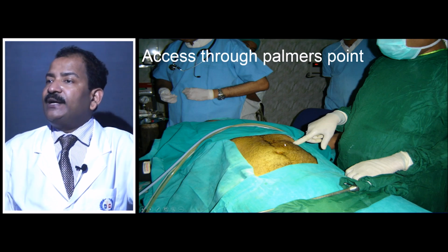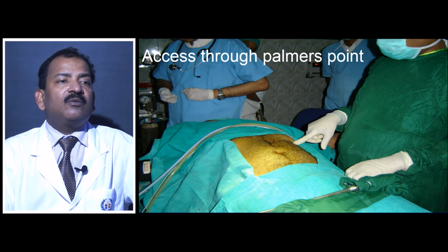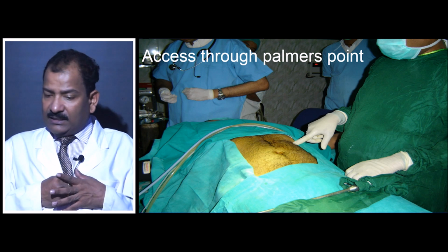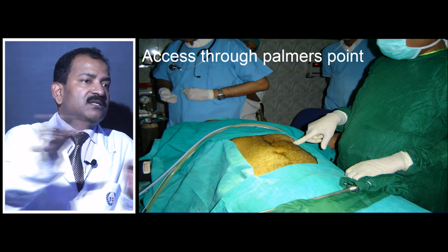Whenever you think that you cannot use the umbilicus for one reason or another, then you should use Palmer's point. Palmer's point is a very good and attractive site, at the mid-clavicular line just below the costal margin, and this is the point here. It has many advantages. One of the advantages is that, in spite of a lot of adhesions in the abdomen, this area is almost always adhesion free, because the stomach is a good organ, it always inflates and deflates, and does not allow any fibroblasts and collagen to grow.